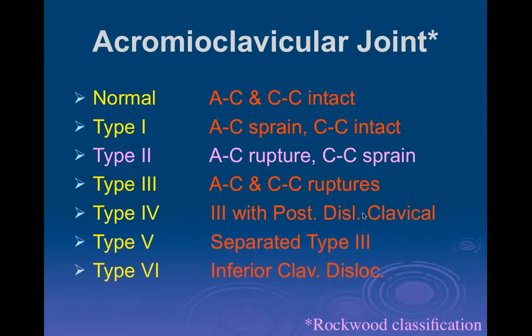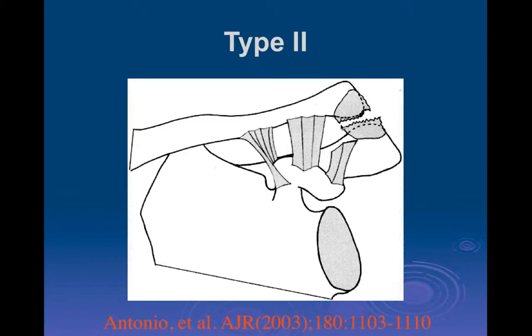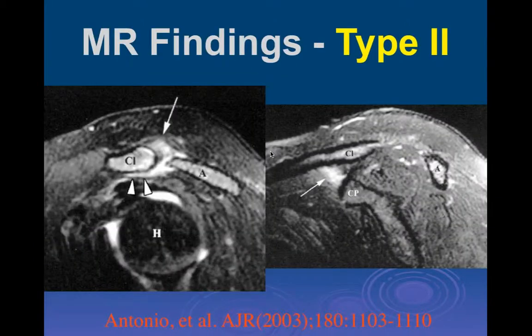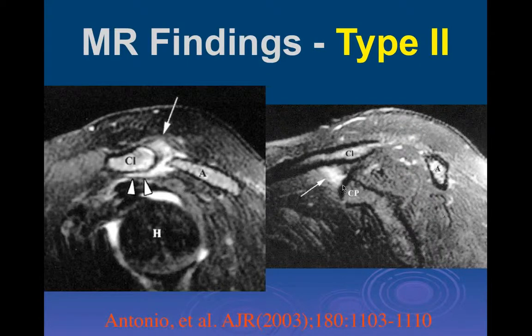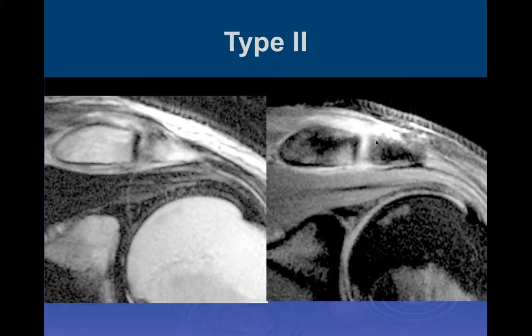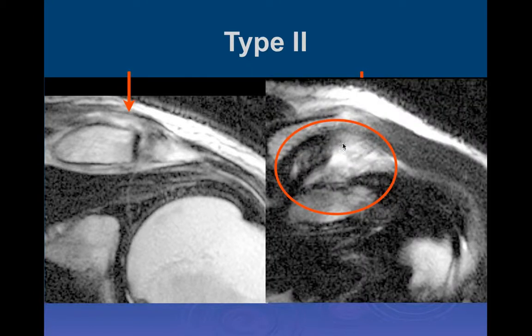Type 2 involves rupture of the acromioclavicular joint capsule and ligaments with sprain of the CC ligaments. There may be slight separation, usually less than a centimeter. On MRI you see abnormal signal involving the capsule and edema in the area of the CC ligaments — with the trapezoid portion showing edema while the conoid is more normal, consistent with a CC ligament sprain. Another type 2 case shows a 13-year-old male with sports injury, with edema surrounding the distal clavicle, fluid with a separated AC joint, and abnormal signal in the CC ligaments.